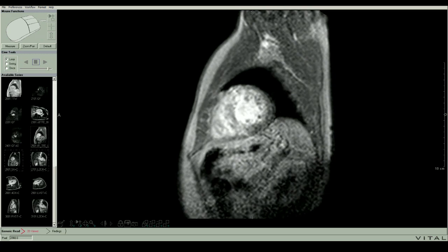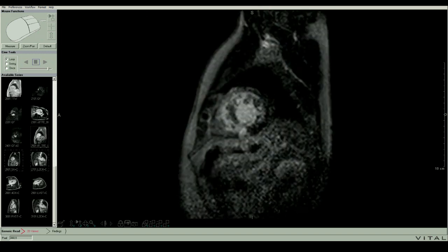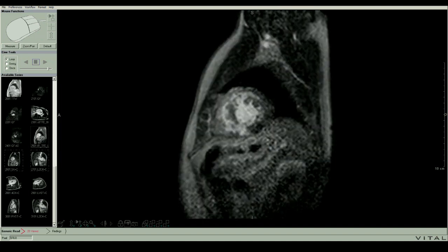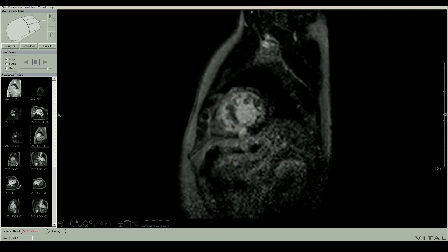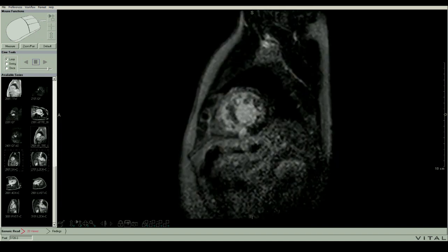So let's go back. Now, in amyloid, you can't null normal wall because there is no normal wall. There's amyloid everywhere, and so we're unsuccessful at nulling the myocardium. And so we think there's something wrong with our coil. We don't think there's something wrong with the patient's heart, but there is. So this wouldn't be amyloid because we are able to null big hunks of the myocardium. So there we go. And there was actually a time when this nulled. It nulls about 180 milliseconds usually as an inversion time.